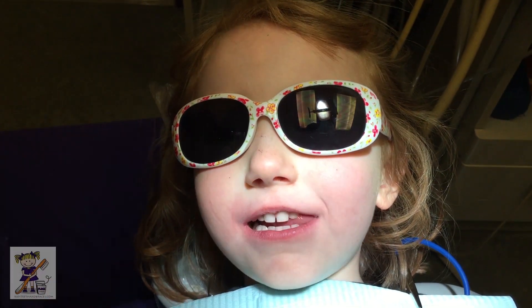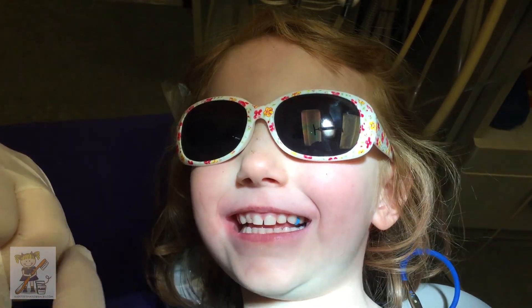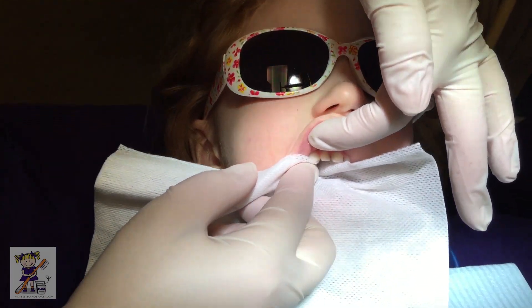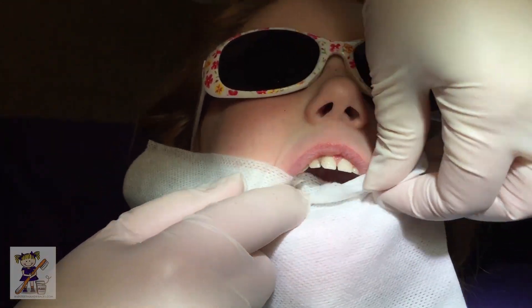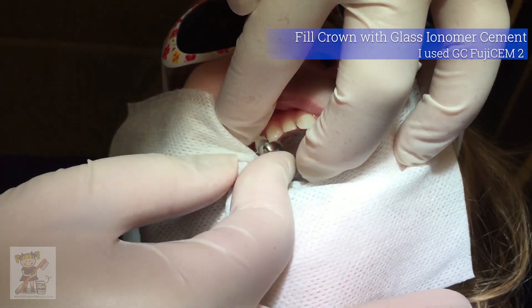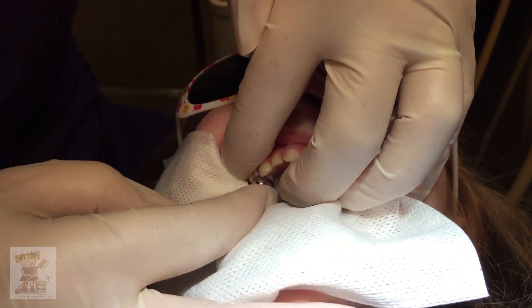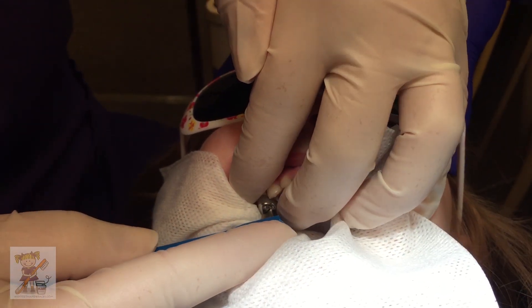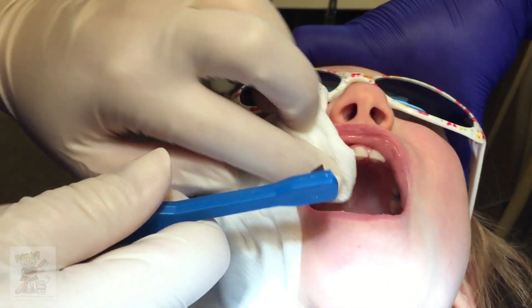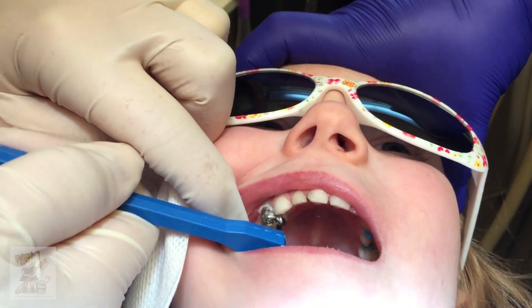You can squeeze Yvette's hand as hard as you want. I need my hands because I'm going to be squishing the crown on there — is that okay? Maybe I shouldn't have offered up your hands! Squeeze it with your big muscles. Can you open really big? It's going to feel tight for a couple of seconds — can you look up high? This is so much better than having to be numb. Can you pass me the crown seater? You're all right — it's not even being pushed down yet. Can you take a big sniff through your nose and squeeze Miss Yvette's hand? Squeeze and push. You're so brave. Can you bite on my little special stick? Bite down really tight. And then open. You're good at this. Bite down really hard. Bite, bite, bite.